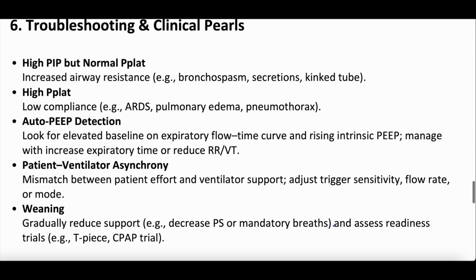I'm going to leave this here in case you want to look at it. This is a little outside of this video, but I wanted to include it here because it helps you understand plateau pressures, PEEPs, auto-PEEPs, ventilator dyssynchrony, and how to wean, which are all separate episodes. But for the sake of comprehension, it's here if you want to pause and take a look at it.